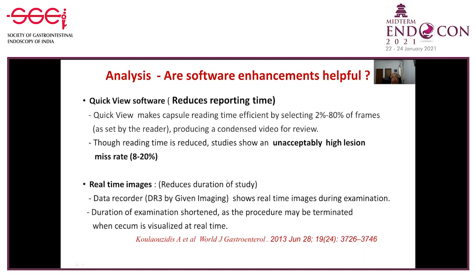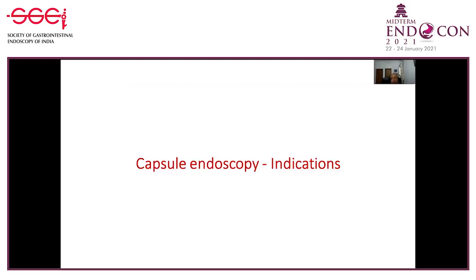Can the duration of the study be reduced? The only way it can be reduced is by using real-time imaging, where you follow the image, and as soon as it comes into the cecum, one can then stop the procedure. So essentially, there are no good software enhancements which are ideal.